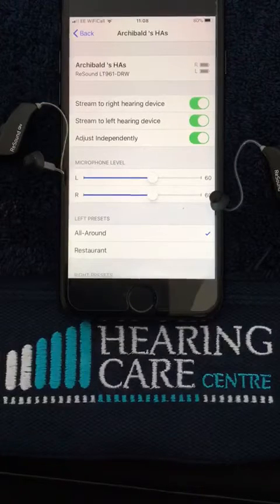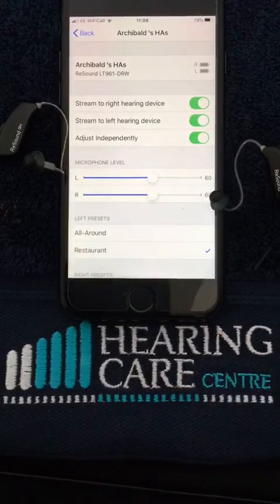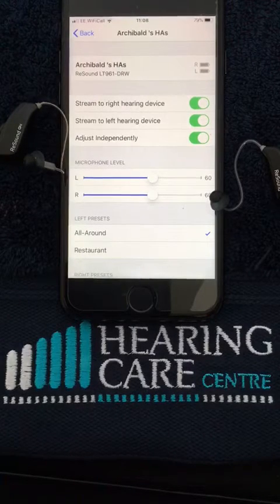For demonstration purposes, I previously installed a restaurant program. If we click on the restaurant program it will change the settings of the hearing aid into the restaurant mode. And if we go back, we go back to our automatic all-around program, which is the default setting when you switch the hearing aids on. And that is really all that's needed to pair your hearing aids to your iPhone or your iPad.